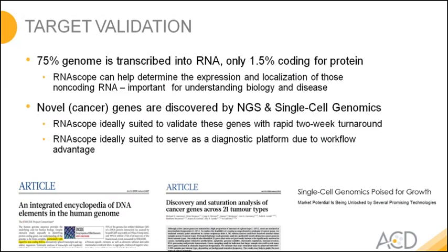Meanwhile, from next-gen sequencing, it is known that a lot of the genome is transcribed into RNA, and only a very small proportion makes it into a protein. This is not yet well understood, and it means that there is also a large and increasing number of new targets, new markers. If you want to rely on antibodies to do the validation, this is probably not really practical.